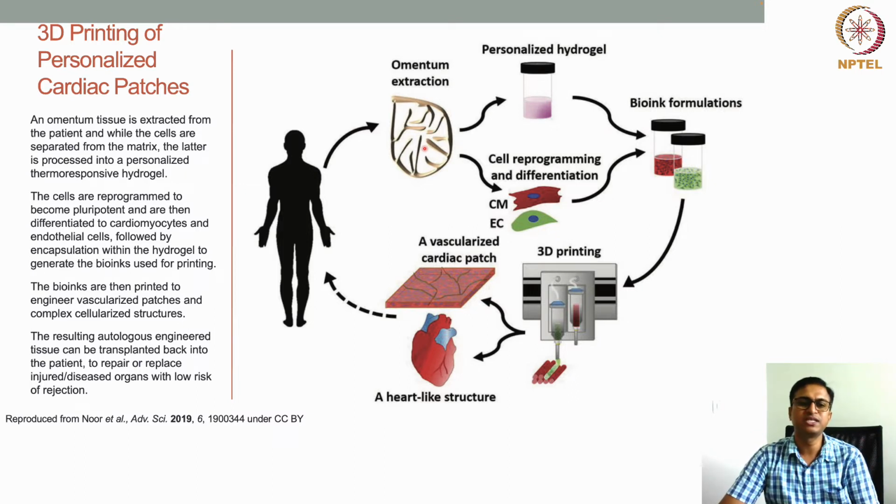And because of this, this hydrogel is a thermoresponsive hydrogel. Another thing is that because it is taken from the patient, it is a personalized thermoresponsive hydrogel. That personalized hydrogel can then be used to develop the bioink, where from the same tissue the cells can be isolated.